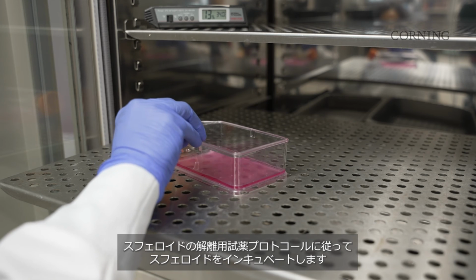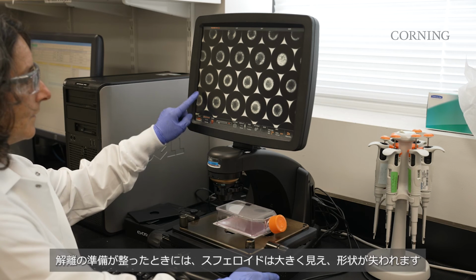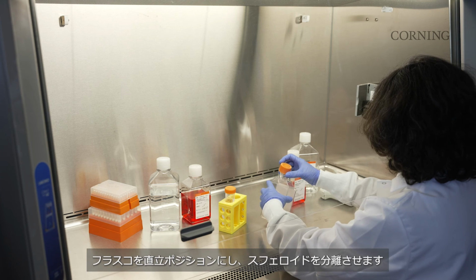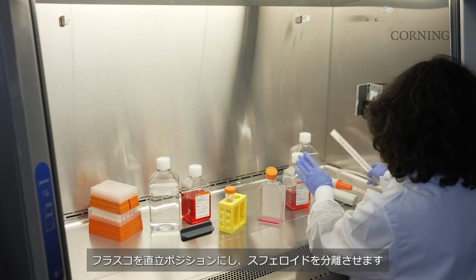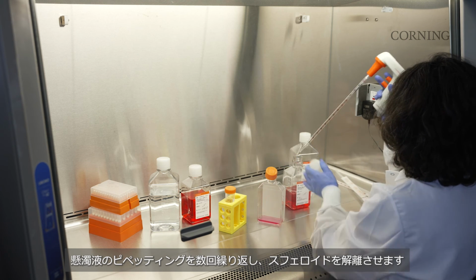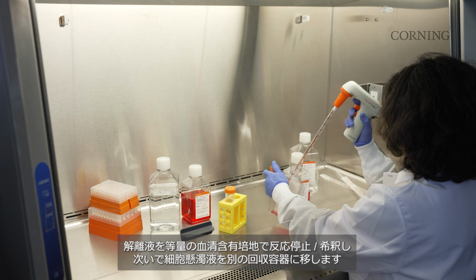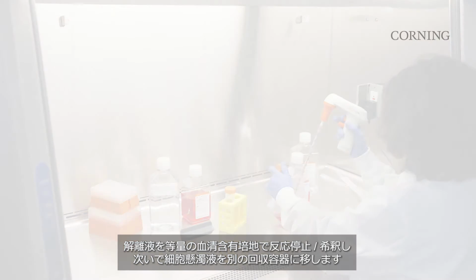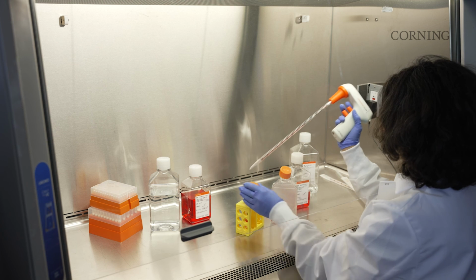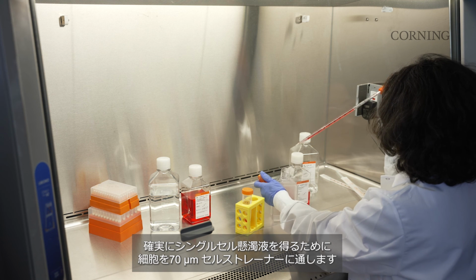Incubate the spheroid cultures according to the dissociation reagent protocol for spheroid culture. Spheroids will appear larger and will lose their shape once they are ready for dissociation. Bring the flask to the upright position to release the spheroids. Pipette the suspension up and down several times to dissociate the spheroids. Dilute the dissociation solution with an equal volume of quenching solution, usually serum-containing growth medium, and transfer the cell suspension to a separate collection container. To ensure single-cell suspension, cells can be passed through a 70 micrometer cell strainer.